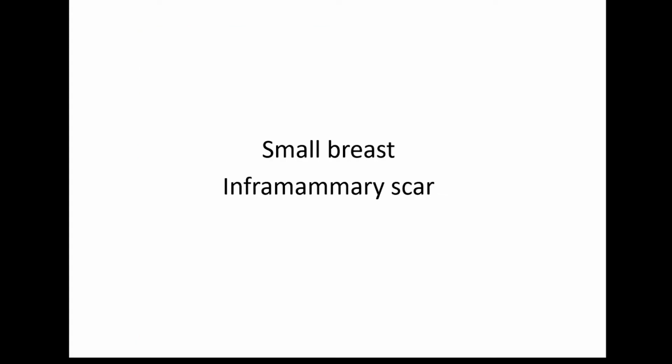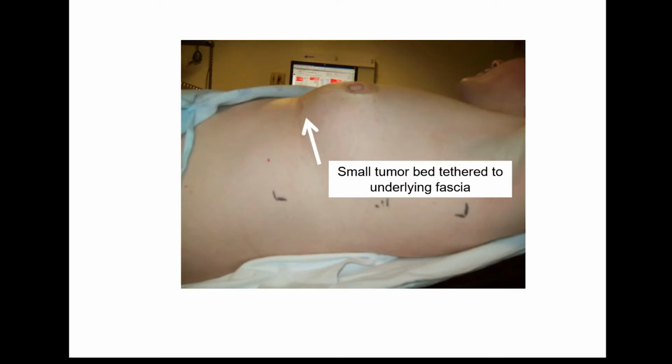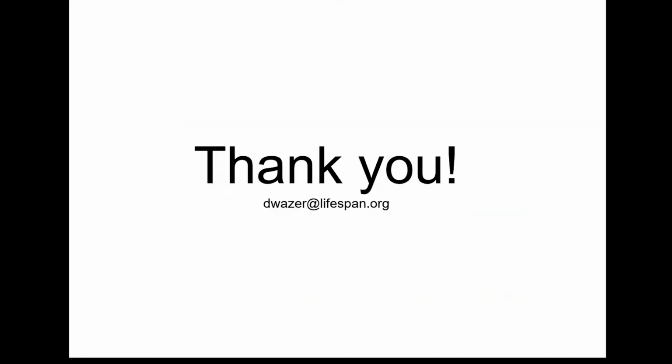And small breast with inframammary scar. Next slide. Once again, relatively small breast, difficult location to get compression. So the periphery of the breast can be a challenge. Next slide. And that's all I have.